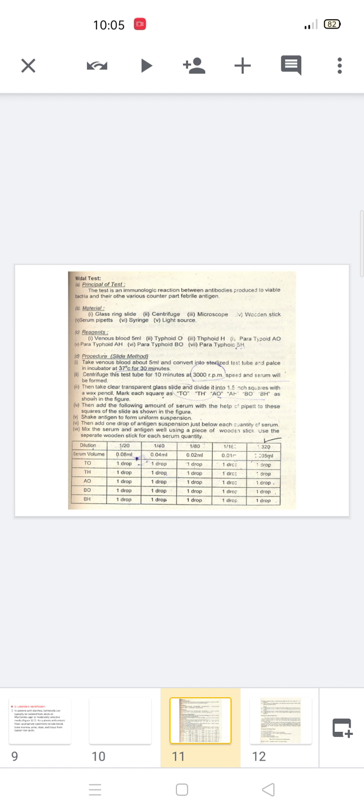So salmonella produce two types of gas. It ferments glucose. By the fermentation of the glucose, production of carbon dioxide produces cracks in the TSI media, colorless cracks.